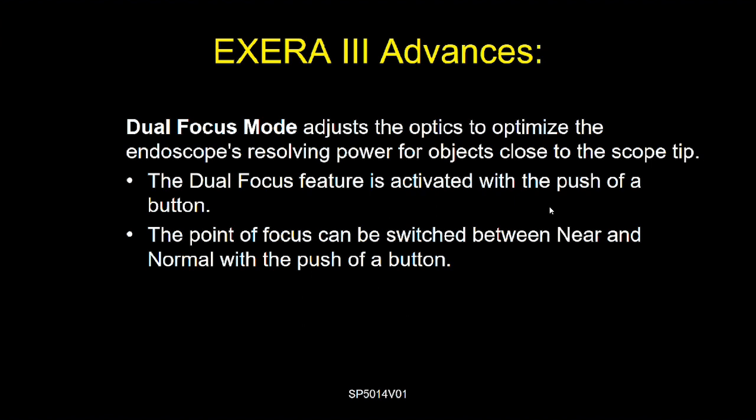Other EXERA III advances include the dual focus mode, which we'll talk about tonight: how to adjust the optics to optimize the scope's resolving power for objects very close to the scope tip. The dual focus, or near focus as it's sometimes called, feature is activated with a push of a button, and the point of focus can be switched between the near focus and normal just by pressing the button that's usually programmed to be on the back of the colonoscope.